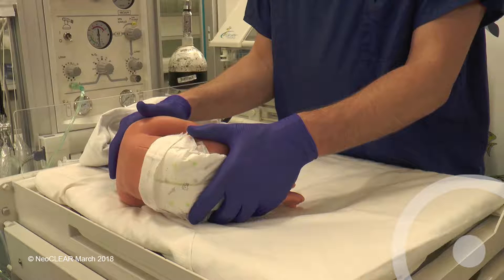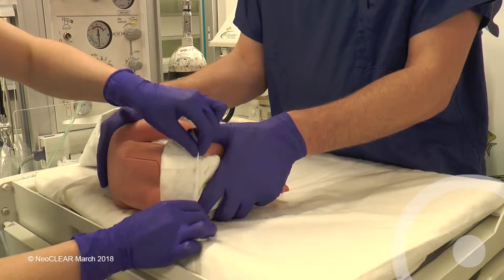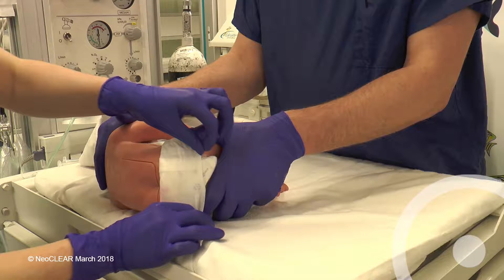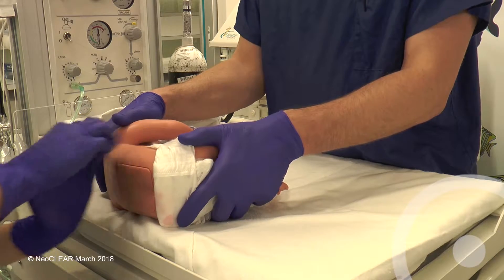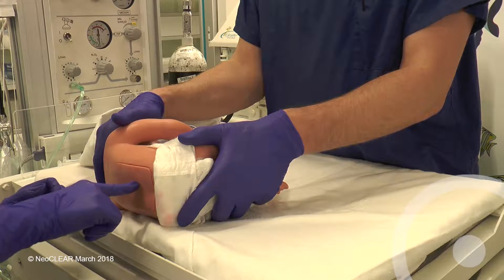Operator and first assistant should be happy with the height of the bed and that the baby can be held correctly. Pull the nappy out of the way. For a lying lumbar puncture, the infant should be held on their side, usually their left, with the spine straight parallel to the bed.